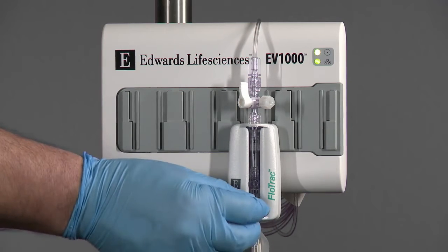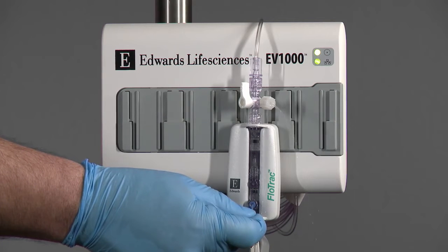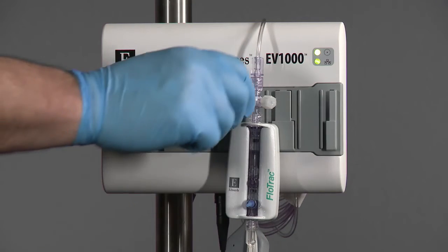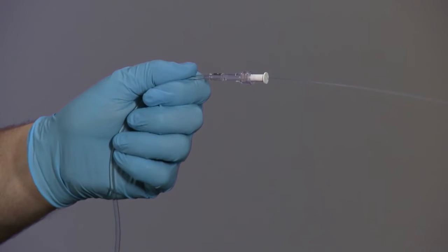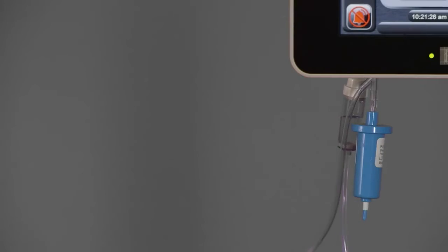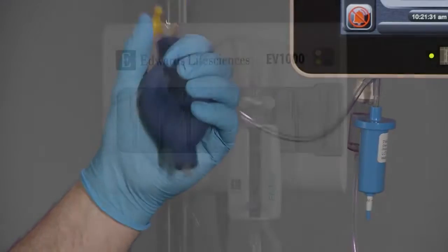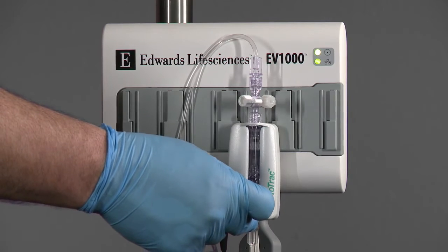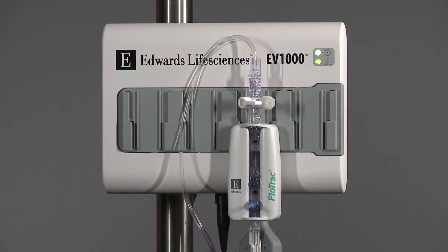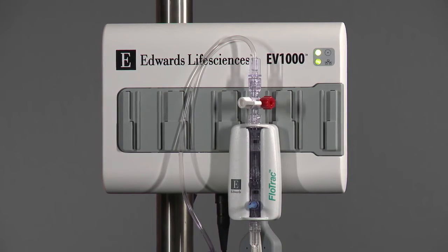Pull the flush tab and prime the FlowTrack sensor through to the vented cap just above the sensor, evacuating all air. Turn the stopcock toward the vented cap and flush to the end of the pressure tubing while holding the pressure tubing upright. Pressurize the infuser bag to 300 millimeters mercury. Pull the flush tab for a fast flush and evacuate any residual air. Replace all vented caps in the system with non-vented caps. This best practice in priming the system will mitigate residual air bubbles.